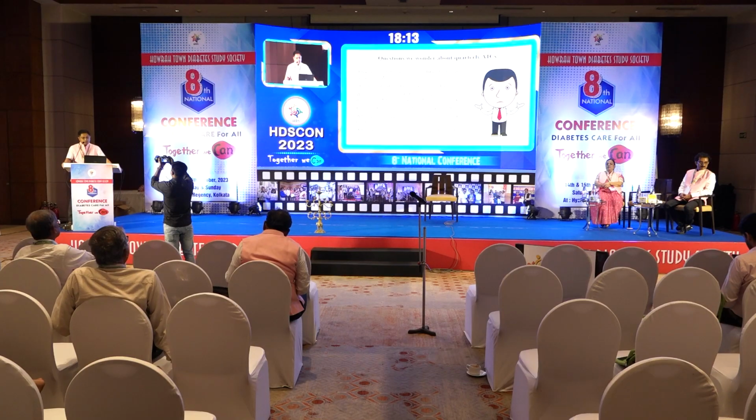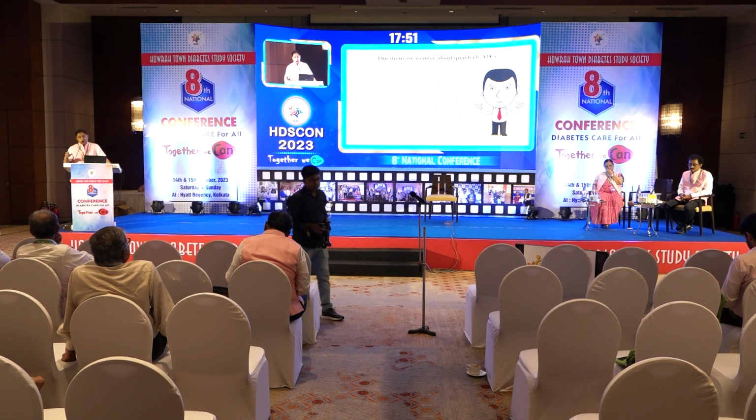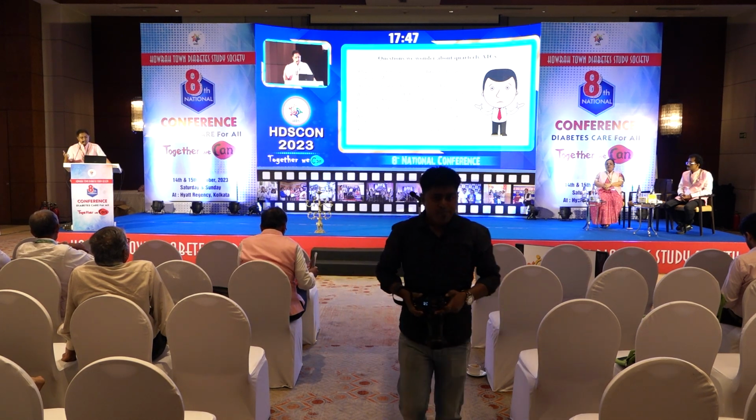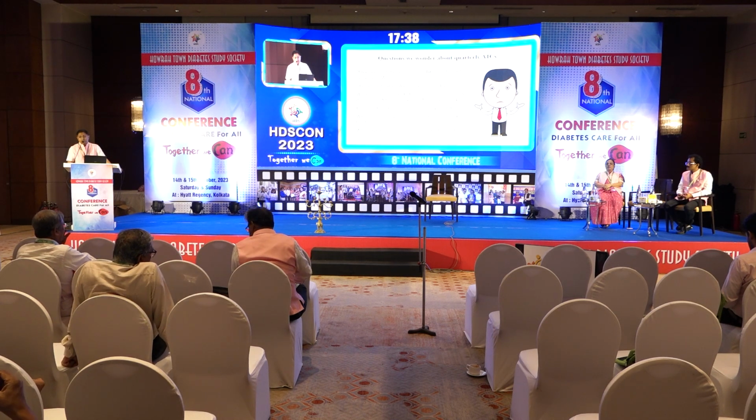So these are the questions that we wonder about the quarterly A1C: what times of the day are in range of the blood glucose, whether it's high, whether it's low, and why it's occurring. Should the medication dose be adjusted? The timing of the medication can be adjusted. What are the issues with the food, sleep, exercise, stress, definitely whether it is working, whether it's not working, the medicines, and if I just made a change in a part of the day, whether it will make any difference. And again, the quality of life, the level of diabetes burden, the experience, experiments that should I go forward. So these are the questions that definitely we don't have the answer with the A1C.